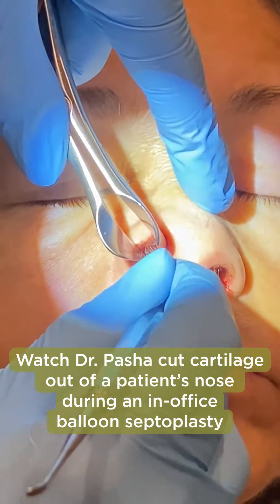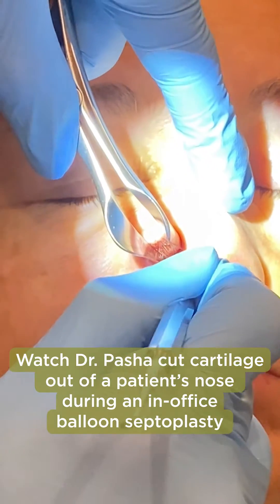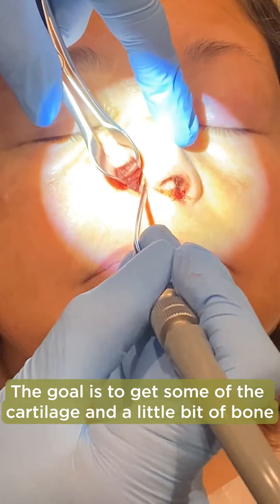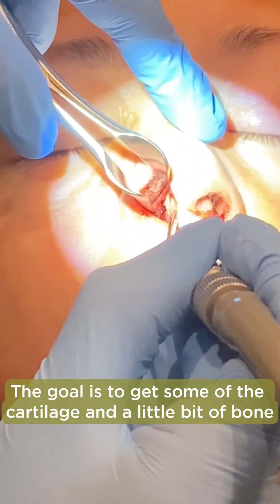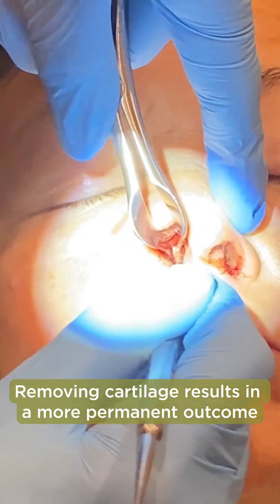I'm going to make an incision through this cartilage — I just need a strip. I'm going to go ahead and lift up the flap on the other side. Again, the goal is just to take a strip down.